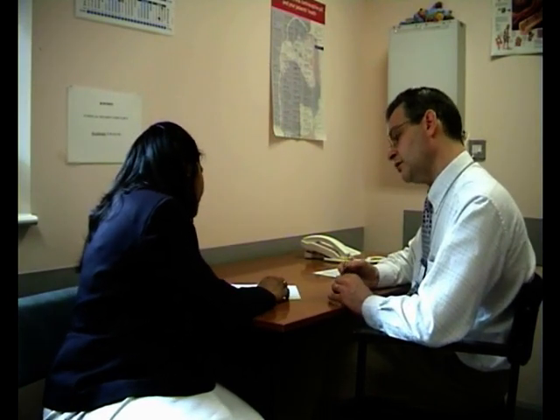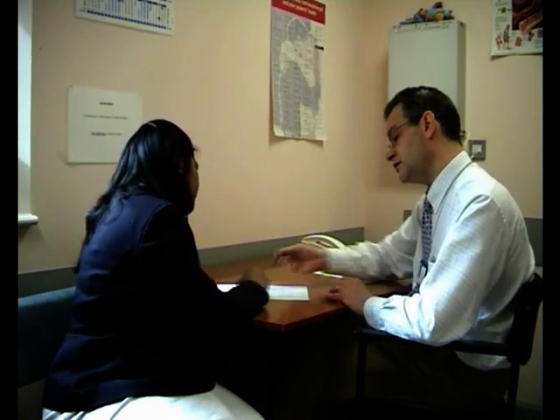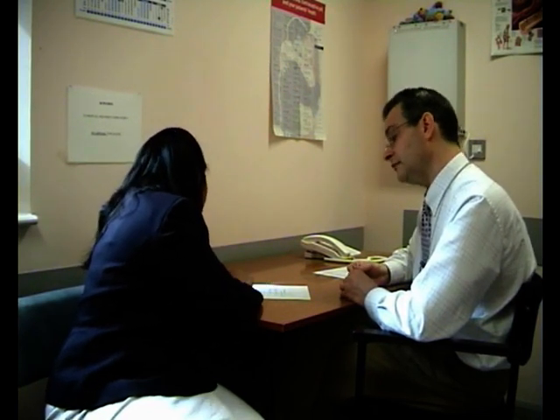Okay, so what else do you like to look at? You're looking at the detrusor pressure line here, which is important. And what else do you like to see while the bladder's filling? You were looking for contractions, that's right. Anything else that's important in that pressure while you're filling the bladder? The pressure rise. And it has risen to 25.